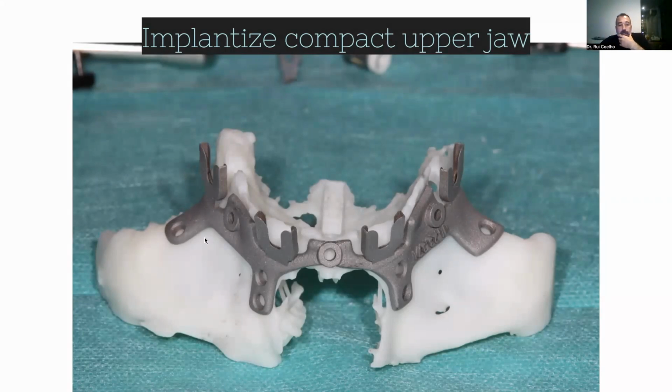Not only that, but we have here 3 points for the fixation of the guide, and then we have 3 points on each side where we can either make a small drill or paint it, okay. This way, when you are going to test the implant, you will see if it is in the right place. The drills that are going to be used make this chamfer outside. You know that buccal exposure is always the problem where we have exposures of the implant.